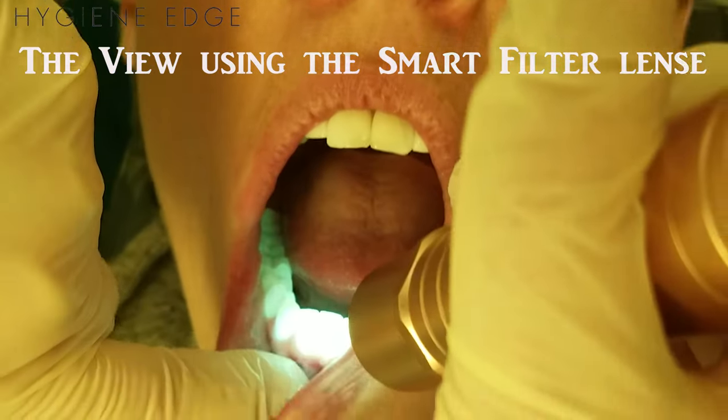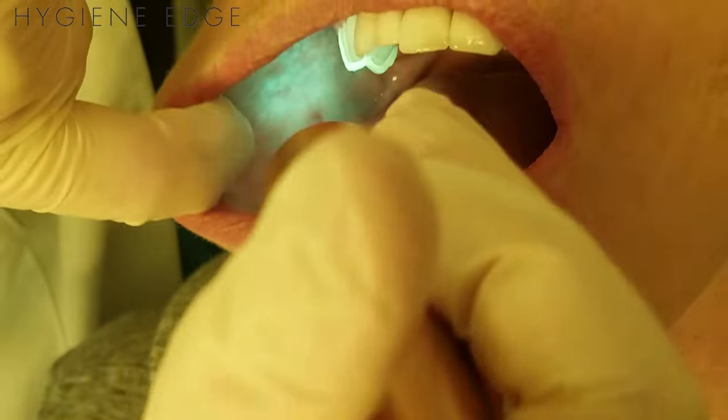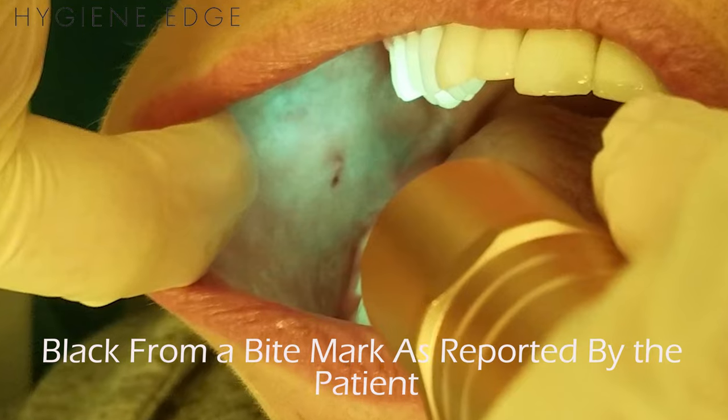The Oral-ID works through a type of fluorescence. The device emits a blue light, but through the specialized glasses, the tissues will look yellow to green, which is healthy, or black, which means it's an area of suspicion.